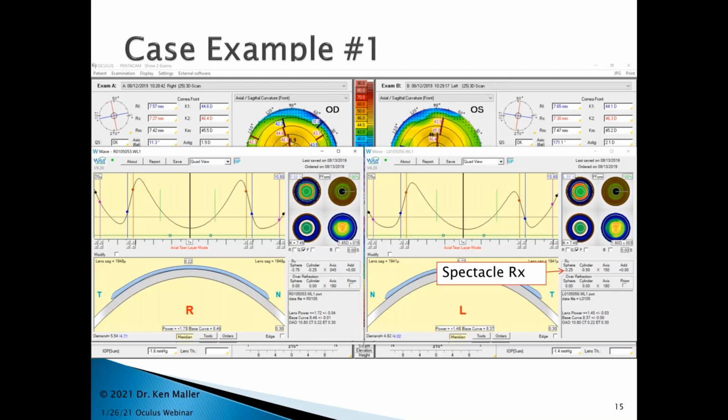You enter the spectacle RX. You can see here I entered in the 3 1/4 minus the half that was sitting on that left eye. There are 3 boxes to check off and decide what type of lens symmetry you want. R is for RSIM, G is for GSIM, and F is for freeform. I have selected GSIM over there for these particular lens designs.